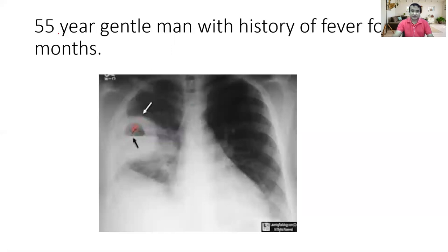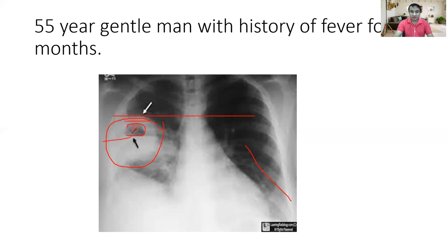Similarly, there is a 55-year-old gentleman with fever for two months duration. After looking at the technicalities, the upper zone seems normal, but in the middle and lower zone on the right side, there is an opacity with a radiolucent area — a definite air-fluid level within the opacity. This chest X-ray is consistent with a lung abscess, where we see this type of air-fluid level within an opacity.